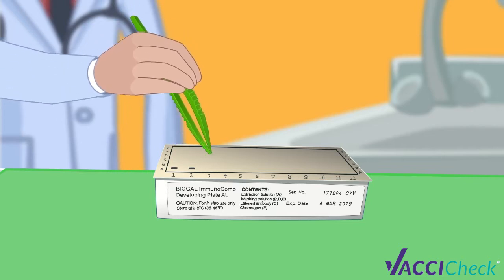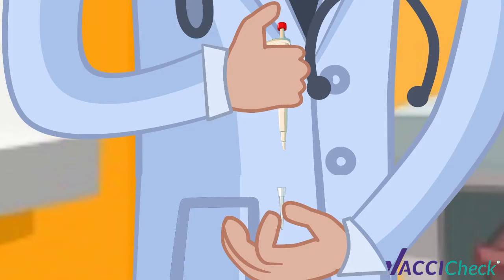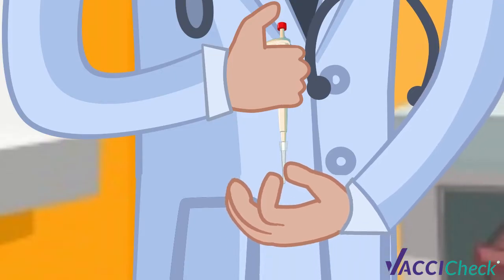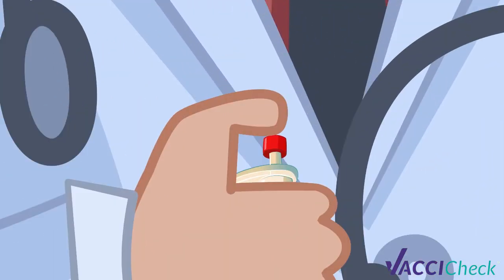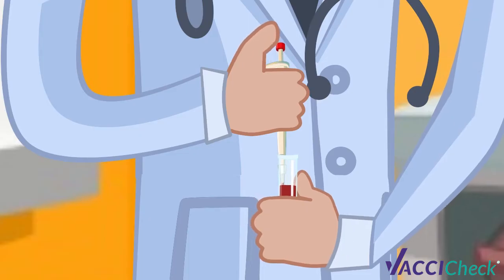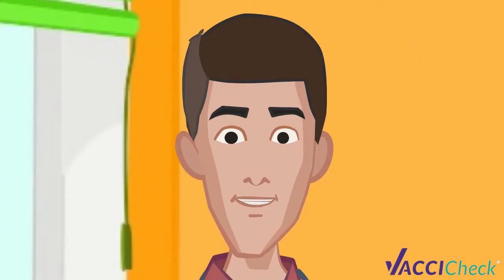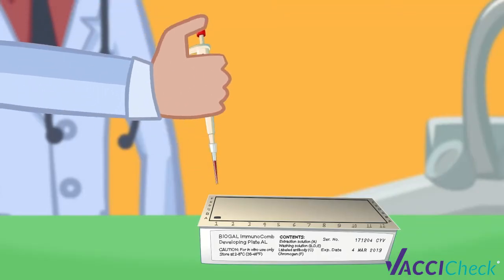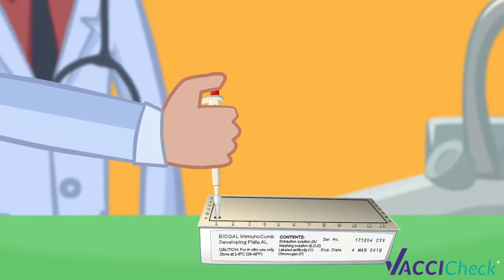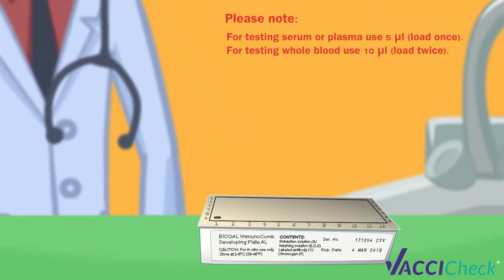Use the tweezers to pierce the protective aluminum cover of row A, one well for each sample. Next, attach the tip to the pipette and press the operating button to the first stop. Then dip the tip into the sample to a depth of about one centimeter and slowly release the operating button. Wait for a while, then withdraw it from the liquid, touching it against the edge of the reservoir to remove excess liquid from the outer surface of the tip. Dispense the sample into a well in row A by gently pressing the operating button to the second stop. While holding the button down, remove the pipette from the well.